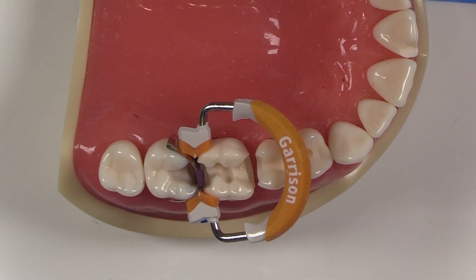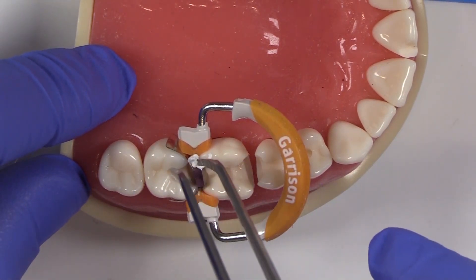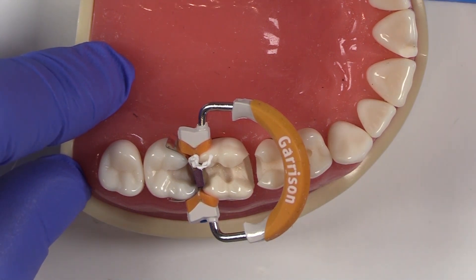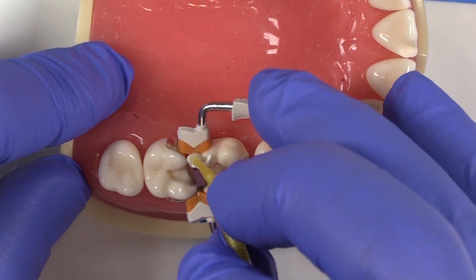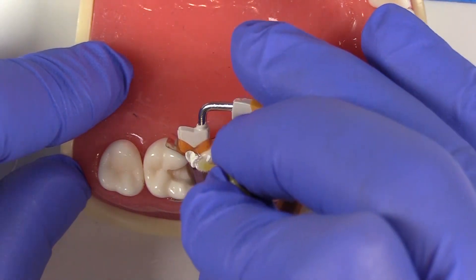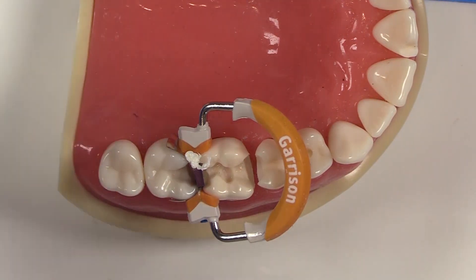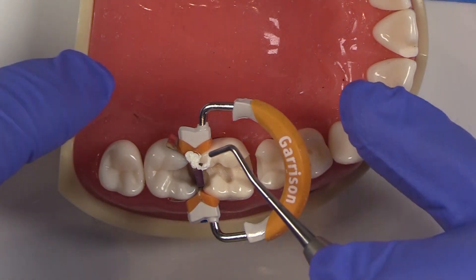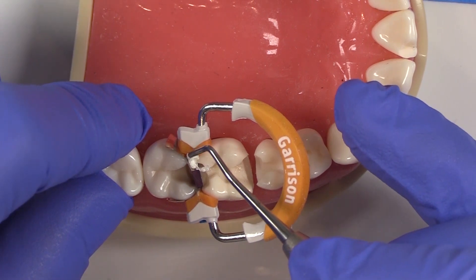So here I have some Teflon tape and I like to place it in there. Teflon tape can be a little sticky — there are a couple of tricks. One of them is to use a micro brush, and one of them is to wet your micro brush, and you can just use that and pack it in. You can also use the rounded end of whatever instrument you're going to use for condensing and get that to go right in place.